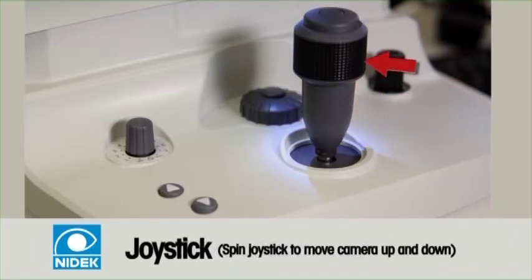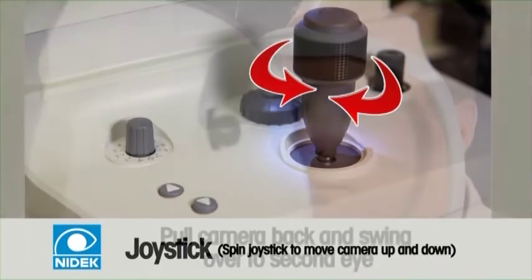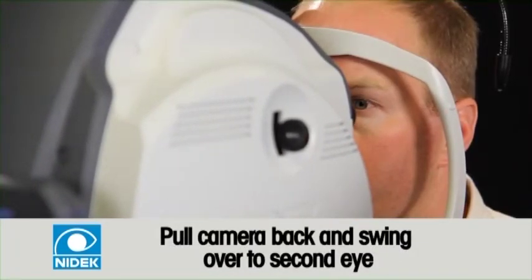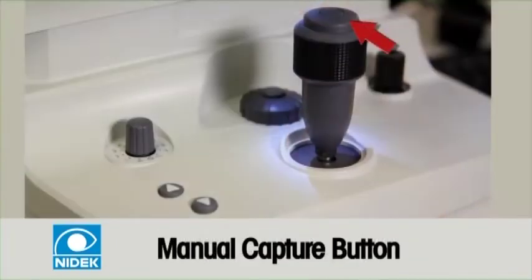In the center, you have the joystick. By spinning it right and left, you will move the camera up and down. Moving the joystick right and left will move the camera right and left. When going from right to left eyes, swing the entire camera from side to side. The button in the center is to manually capture an image.